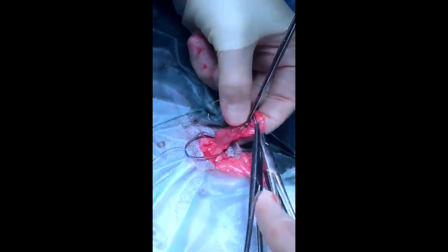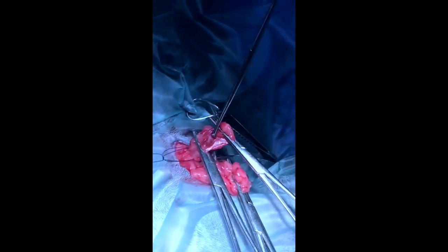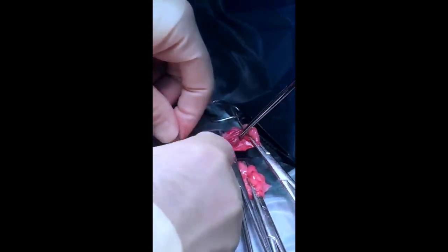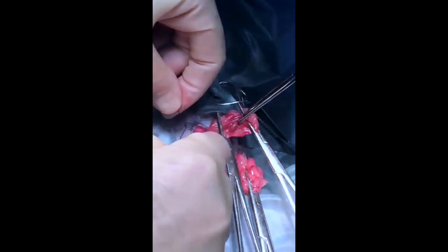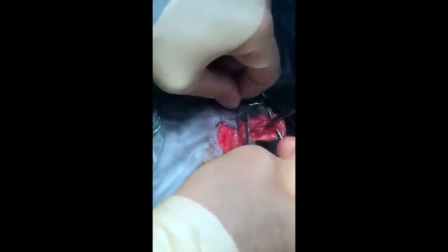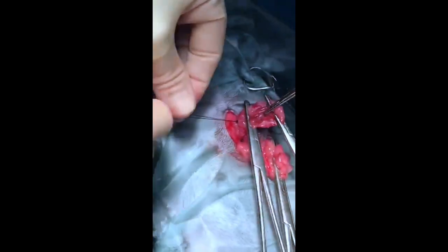Then palpate the ovary and apply another pair of forceps just proximal to it while we're cutting along the top of this pair of forceps. Adjust the tension on the Allis tissue forceps and then slowly slide down the constrictor ligature. A little tension and you can feel it lock very quickly, then apply some locking throws out of the top. And that's it.